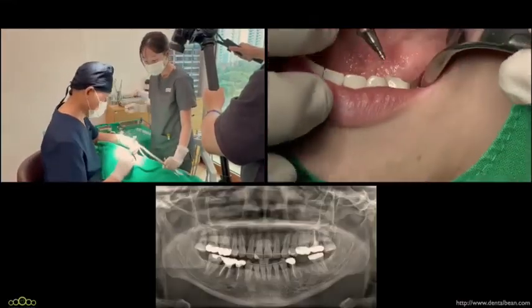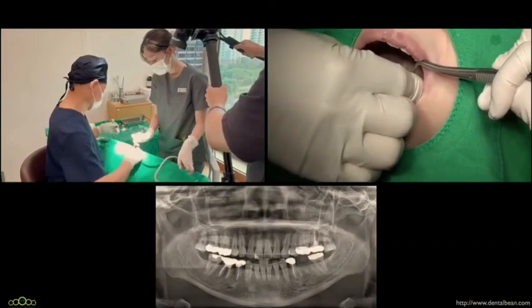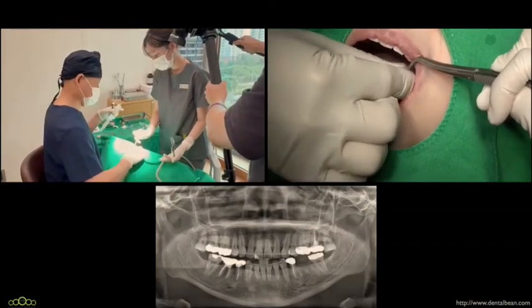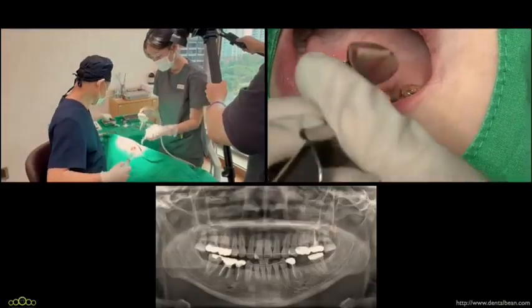Okay. In this video, there is no interruption. It is 4 minutes from starting to connecting the healing abutment. Okay, it finished.